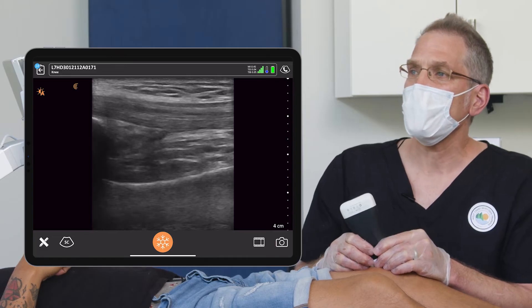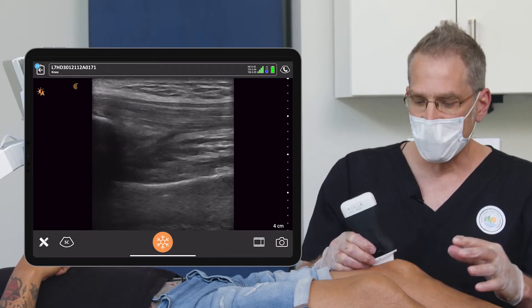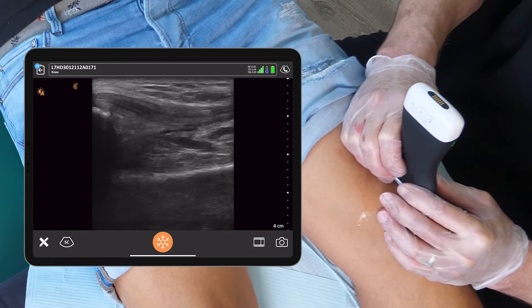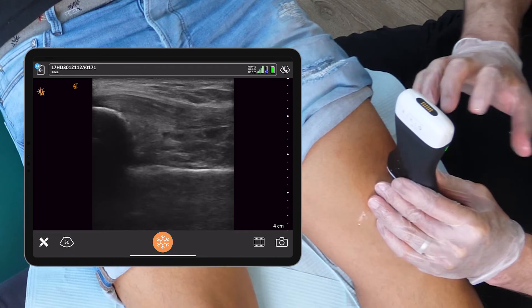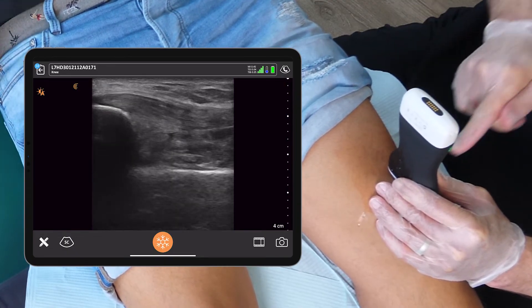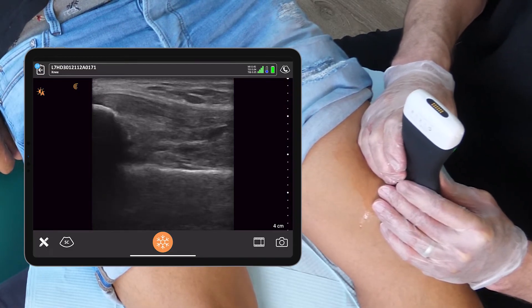In Rico's case, there's not a lot of fluid. It's also important to note that the capsule extends proximal to the patella and the lateral gutter — the lateral aspect of that pocket is typically quite a bit larger. If there's a large knee effusion, that fluid will fill the lateral gutter and you can access it with a very short needle from the lateral side of the leg.